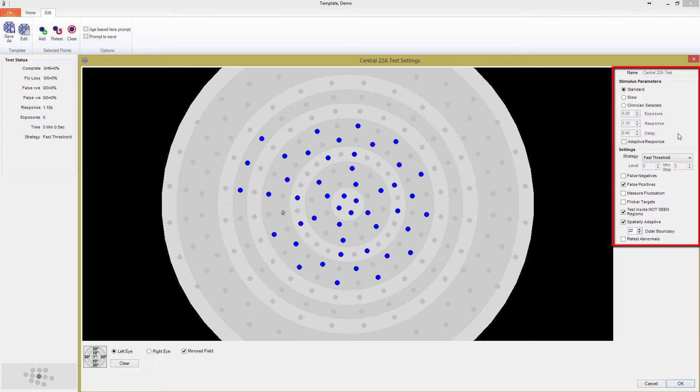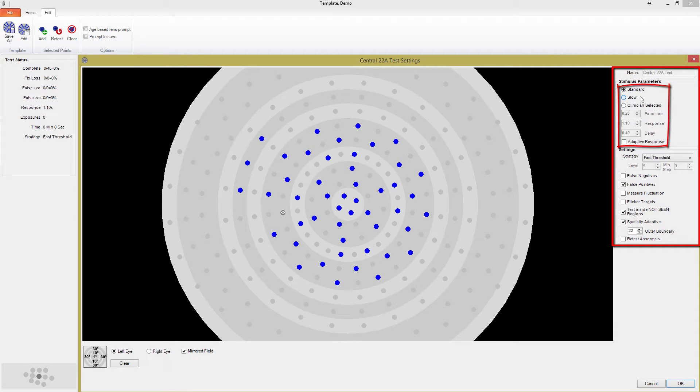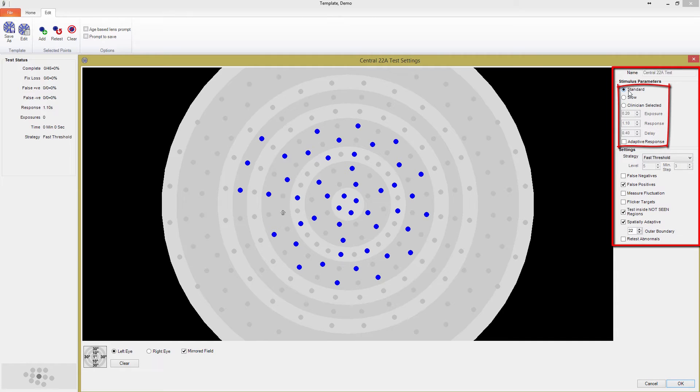You have quite a bit of control over this section. Standard and slow options correspond to the fast and slow buttons in the main test window. As you can see when I select slow, this option simply gives the patient a little more time to decide on the response, by increasing the response and delay times.